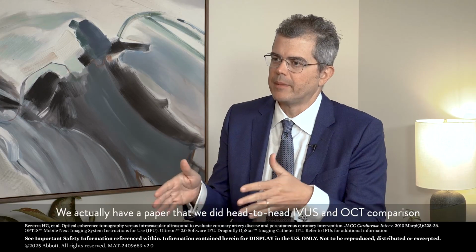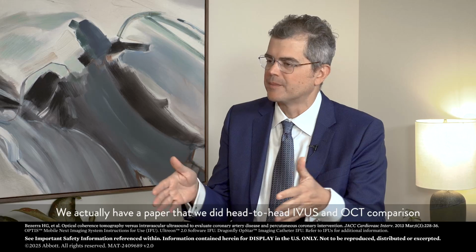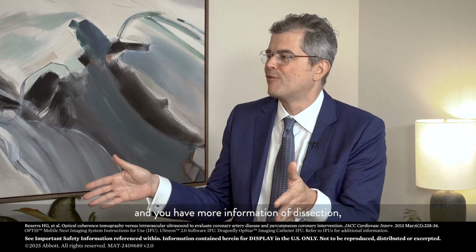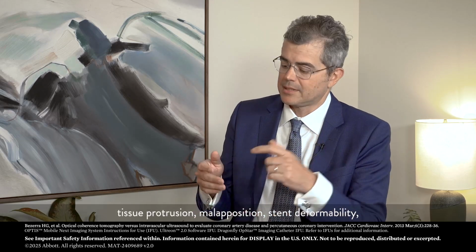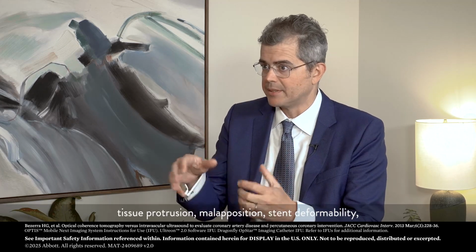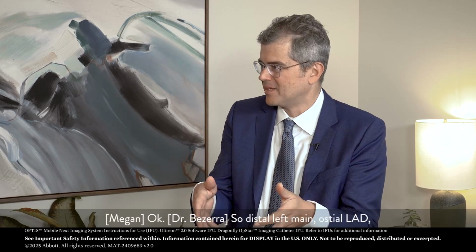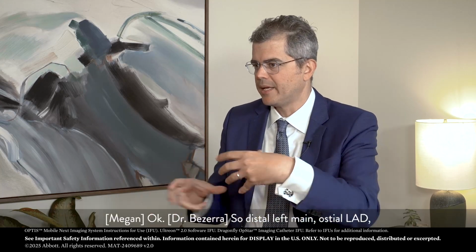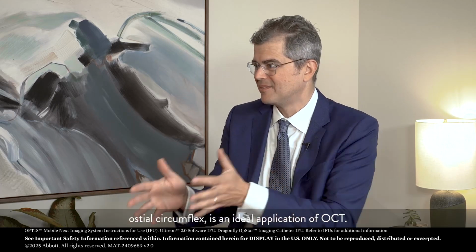We actually have a paper where we did a head-to-head IVUS and OCT comparison, and you have more information on dissection, tissue protrusion, malapposition, and stent deformability on the OCT arm than you get with IVUS. Okay. So distal left main, ostial LAD, ostial circ is an ideal application of OCT.